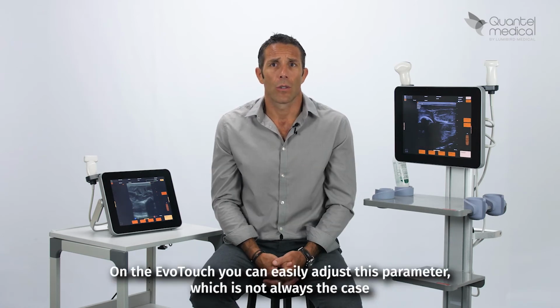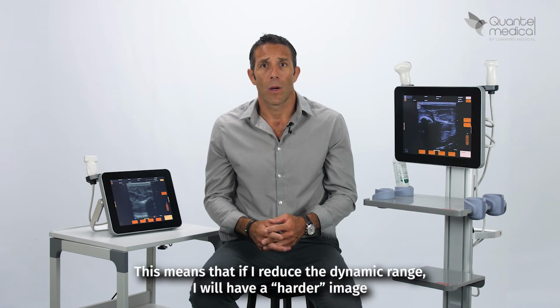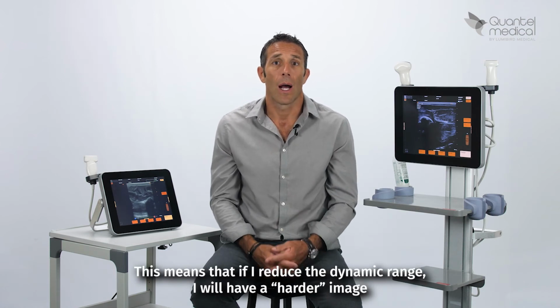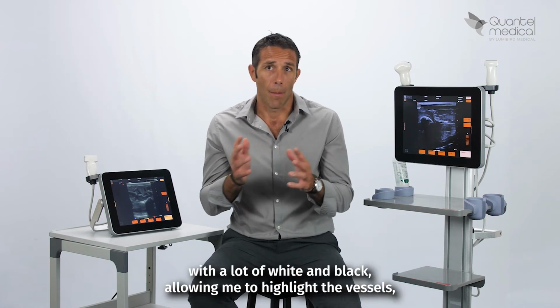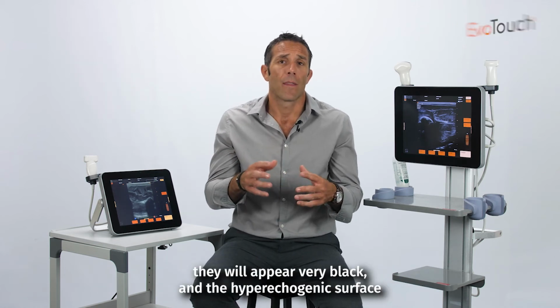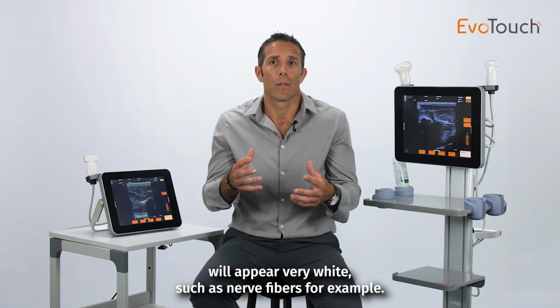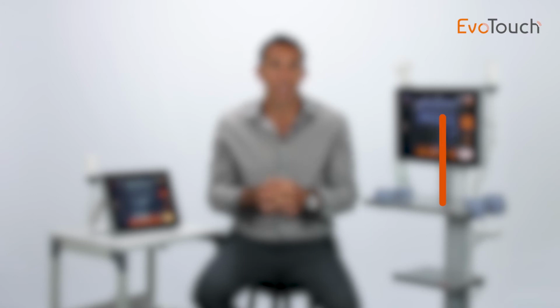On the EvoTouch, you can easily adjust this parameter, which is not always the case on other devices. This means that if I reduce the dynamic range, I will have a harder image with a lot of white and black, allowing me to highlight the vessels, they will appear very black, and the hyperechogenic surfaces will appear very bright, such as the nerve fibers, for example.